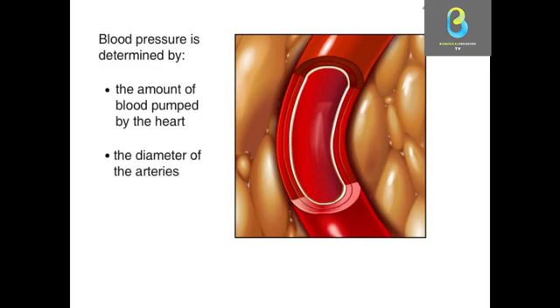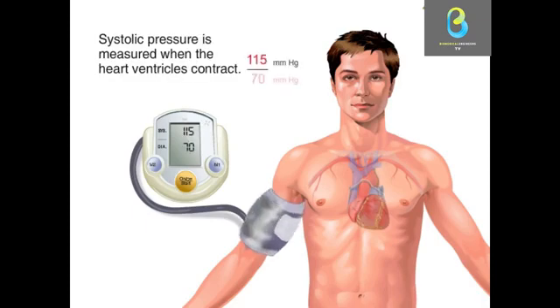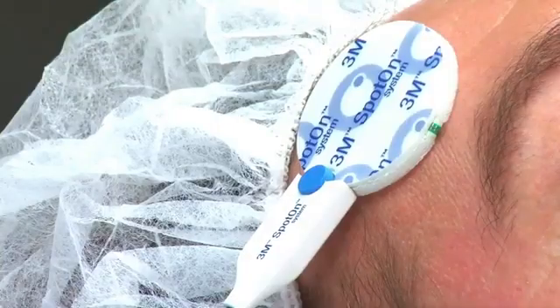Pressure in the cuff is then released at a particular rate. When it reaches a level below the systolic pressure, a brief flow occurs. If the cuff pressure is allowed to fall further, just below the diastolic pressure value, the flow becomes normal and uninterrupted. The measurement consists of systolic, diastolic, and mean pressure. Let's move towards temperature measurements.